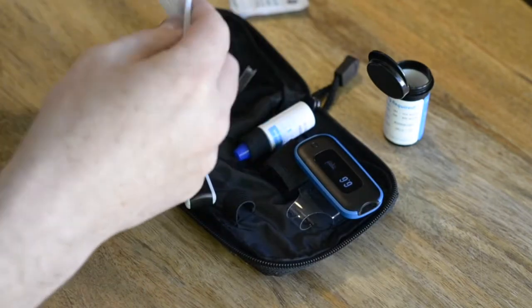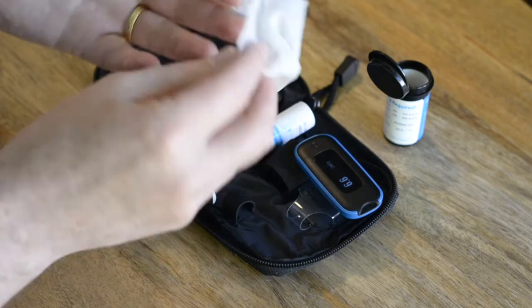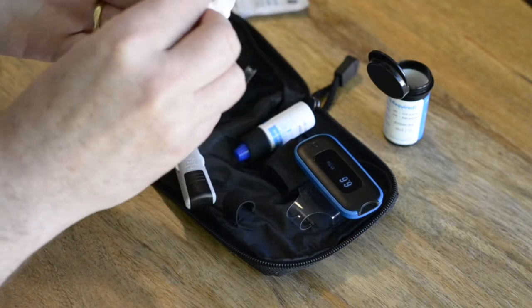Ensure that you thoroughly clean the area of your fingertip where you intend to make the prick with an antiseptic wipe.